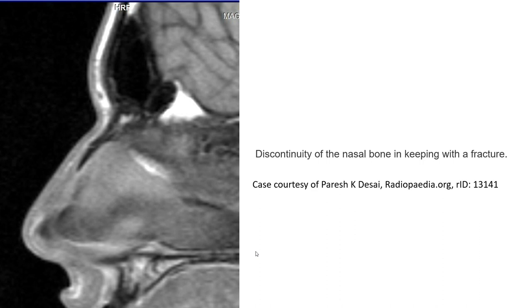Another case showing the discontinuity of the nasal bone, in keeping with a fracture, which you can see here.